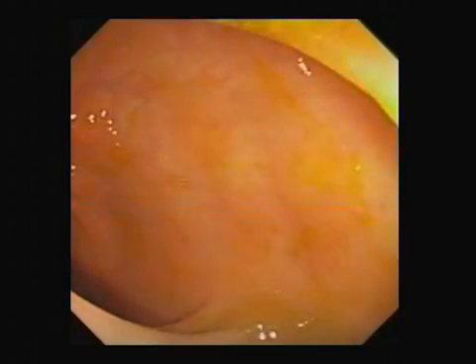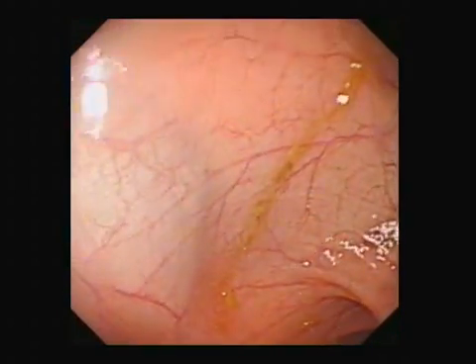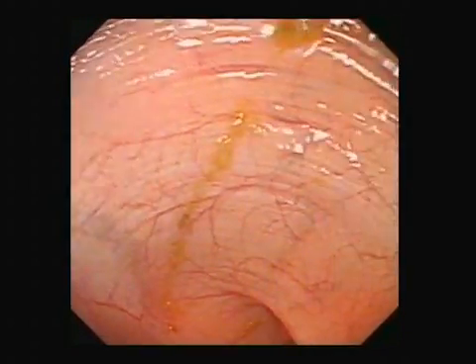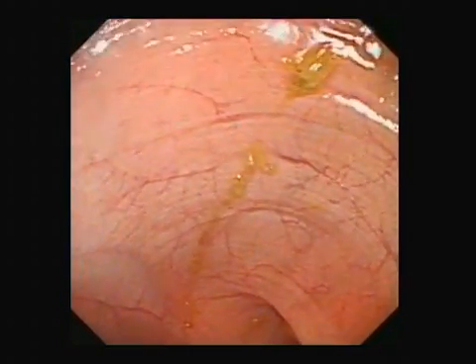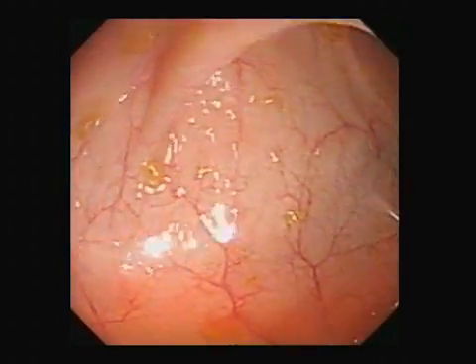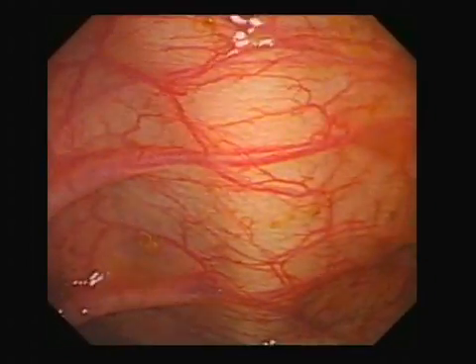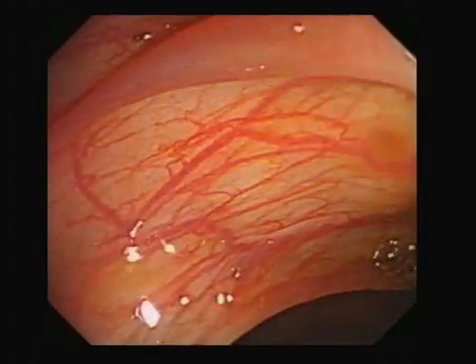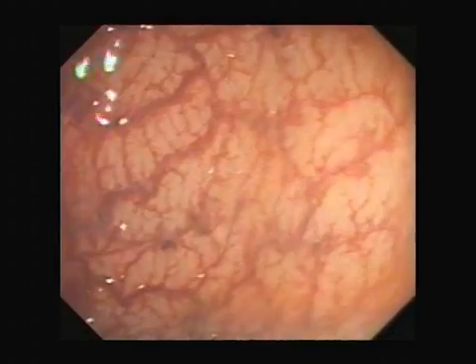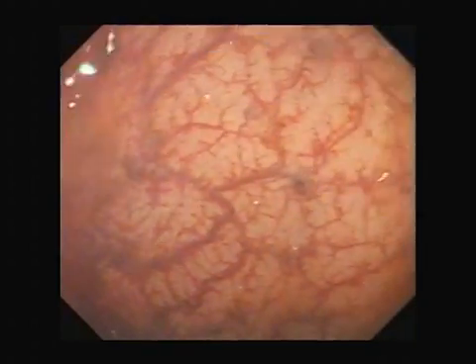The innominate grooves, often invisible clefts in the mucosal surface, run transversely around the colon. Circular muscle fibres can indent the transparent mucosal surface, which shows its fine vessels or vascular pattern. Often the vessels are seen to be paired, arterioles and venules running together. Venous lakes, dark blue raised blebs, are a normal variant of no significance.